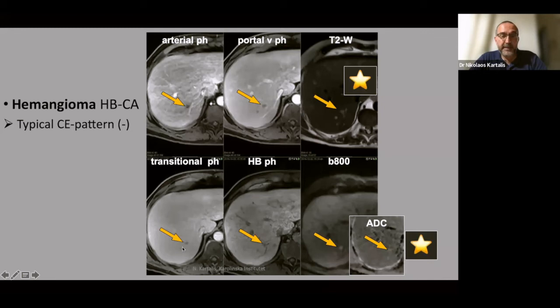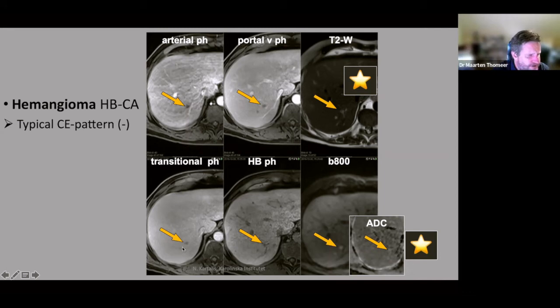However, if the lesion is in the body or the tail, or in the head but the patient has an endoprosthesis, then, at least in my experience, Primovist works better. But you need to have the patient. I missed a part. What did you say? Can you recall the last sentence? Yes, I said that if the lesion is obstructing the common bile duct, the patient is... No, if not, what would you give then? I would go for the Primovist.